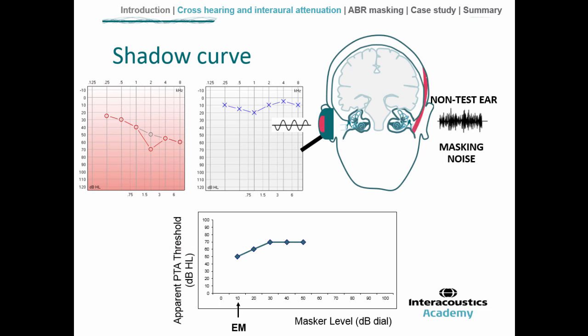Now I'm just going to move on to considering some separate considerations for masking the ABR.